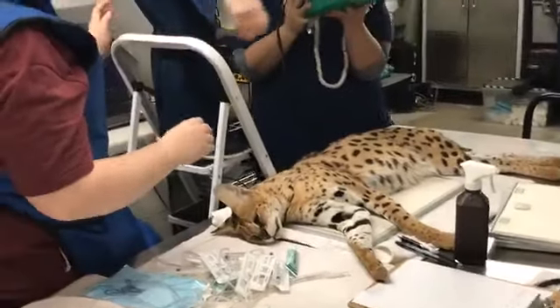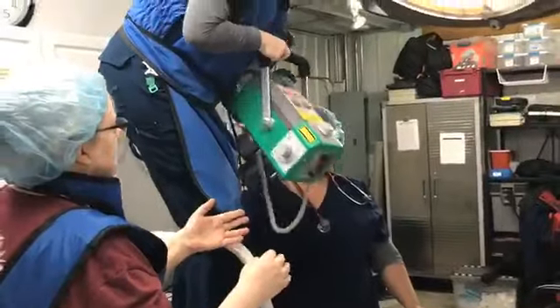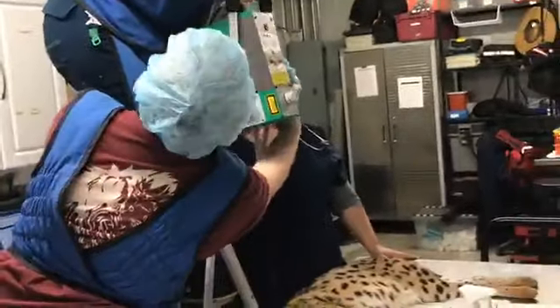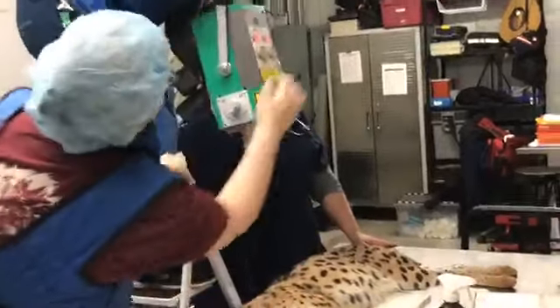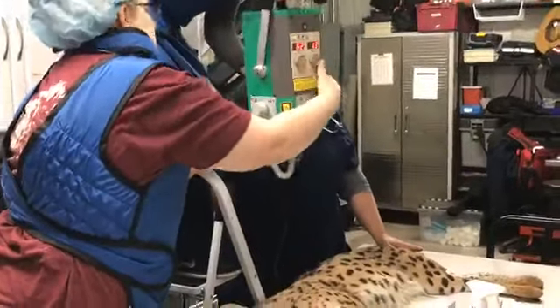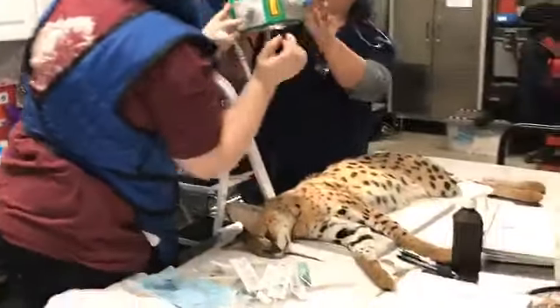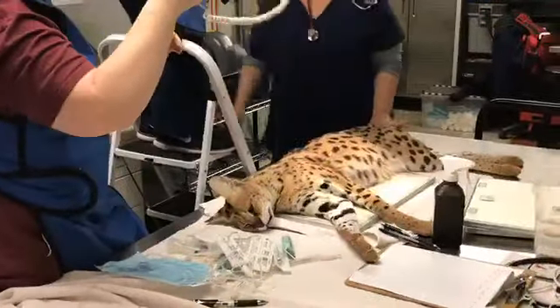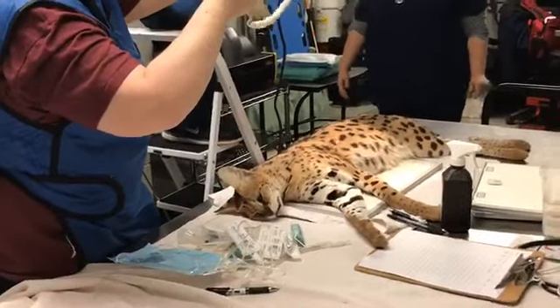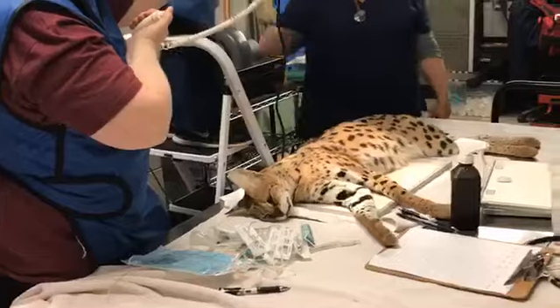So they're prepping the x-ray, and that x-ray might look like it's nothing, but it weighs a good 50 to 60 pounds. So you want to make sure that you've got a good grasp of it. It can get tiring to do, but it's such an important thing. And that radiograph x-ray is mobile, so we can bring it down into the field, into the cats' rooms who aren't coming up to the hospital. So the babies are doing good.